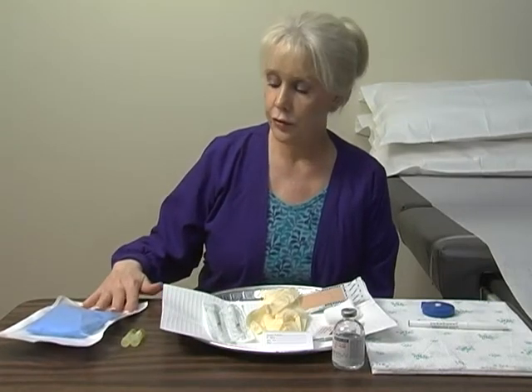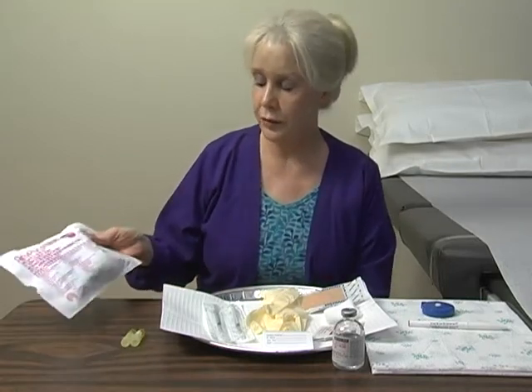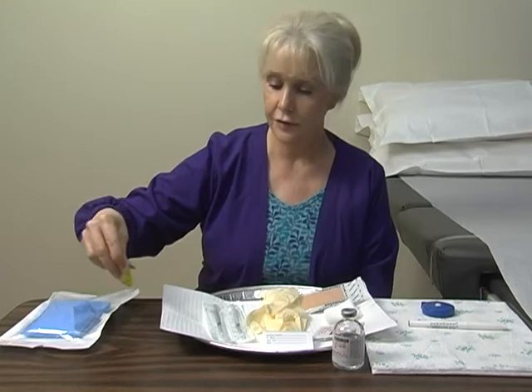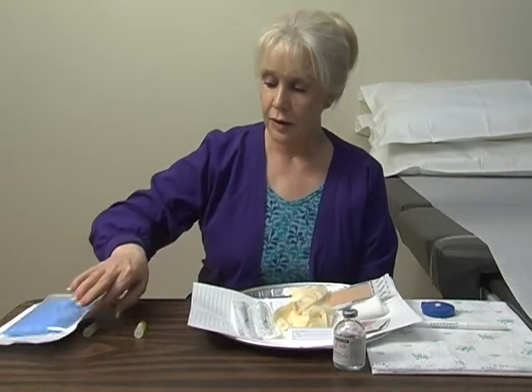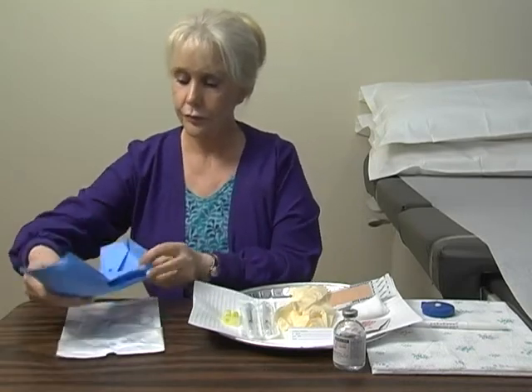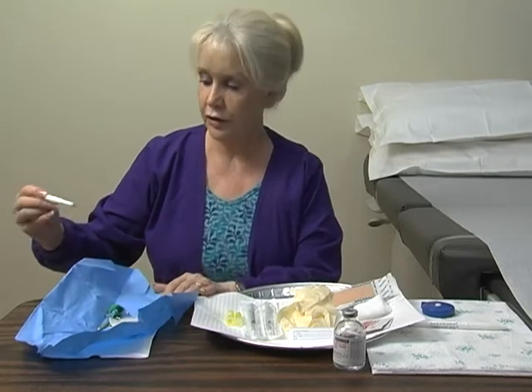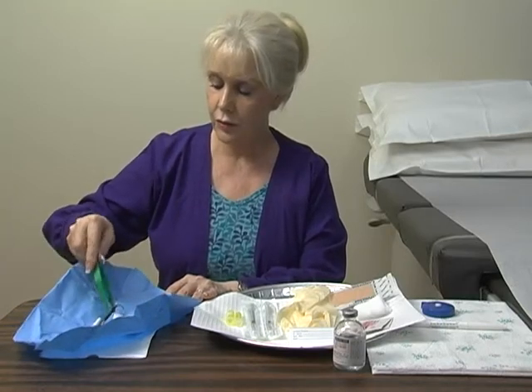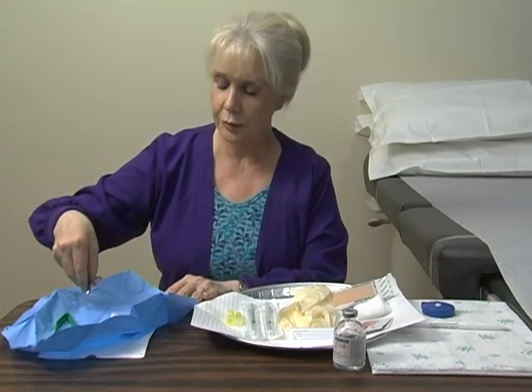The supplies you'll need to do your epidermal skin biopsy — first of all, is a punch kit. We will be providing the punch kits to you, as well as the Zamboni fixative. Located within the punch kit is your three millimeter punch. You need at least three millimeters or greater to do these biopsies. Also included are plastic forceps and a pair of scissors to reach under and release the specimen.